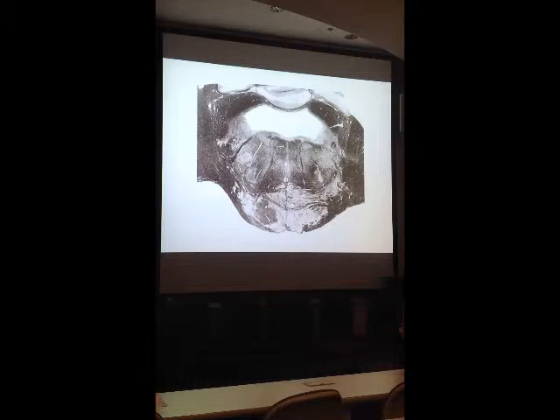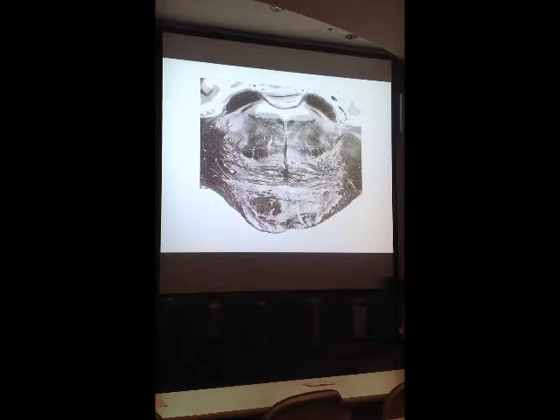Now, again, in the lower pons, you should expect to see, based on what we said previously in lecture, that there should be some vestibular nuclear complex, because the vestibular nuclear complex is really big. It's present in the lower pons, actually right here in the lower pons, and then extends downward into the upper medulla. So we'll see that on subsequent slides through the medulla. So again, vestibular nuclear complex. Now again, because we're below the chief sensory nucleus of the fifth nerve that we saw on the previous slide, if I went back here.